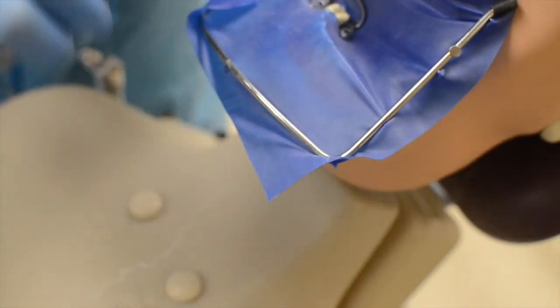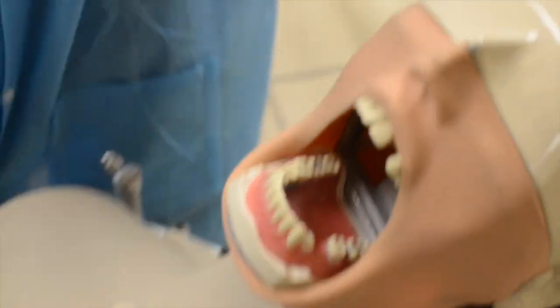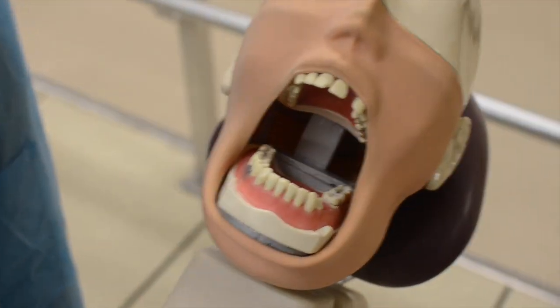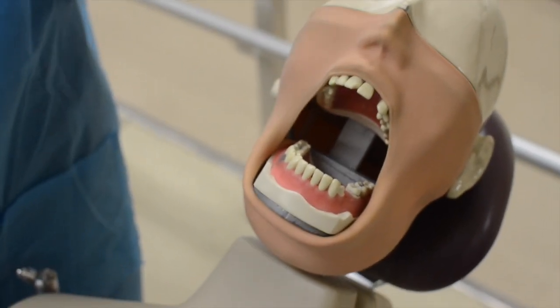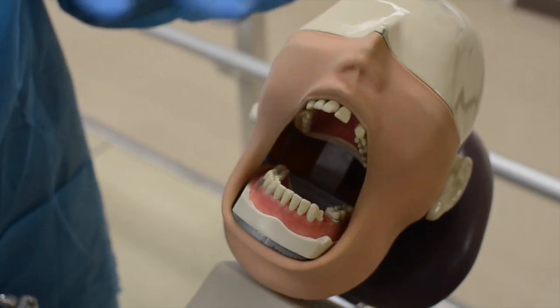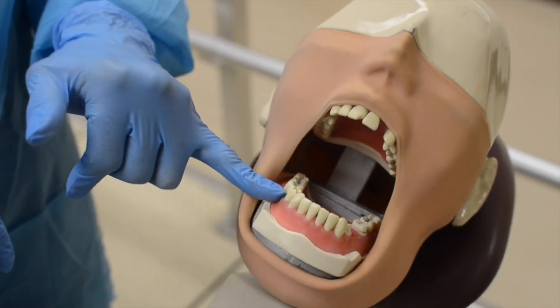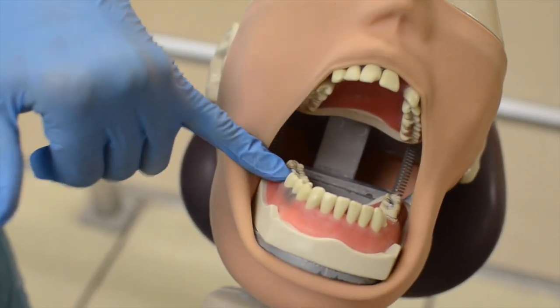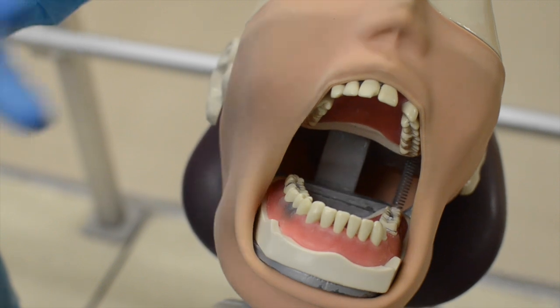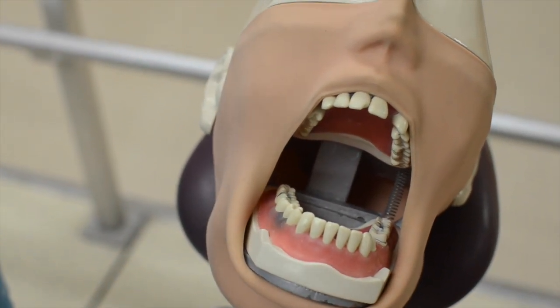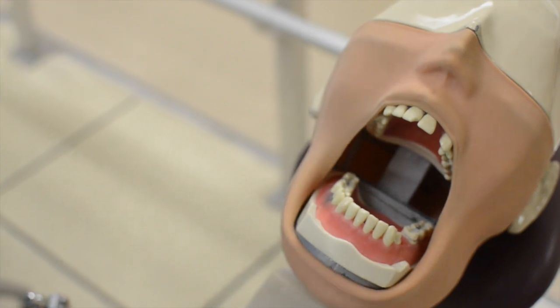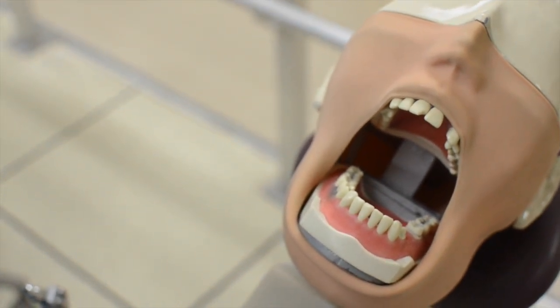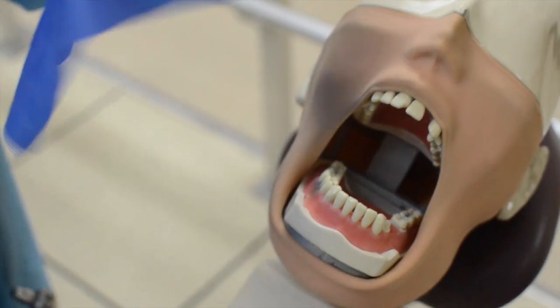There's one other thing I want to show you. If you're just doing one tooth, and that one preparation is not a class two. Now if it's a class two, you want the retainer to be ideally two teeth distal to your class two, the tooth that you're working on. If you're doing a class two on 29, ideally the clamp would go on tooth number 31. Because when you're doing a class two, you're going to have a matrix band on the tooth and you don't want the clamp to interfere.